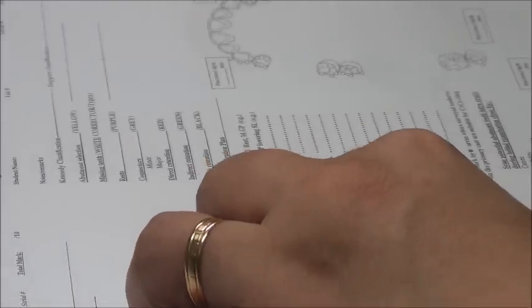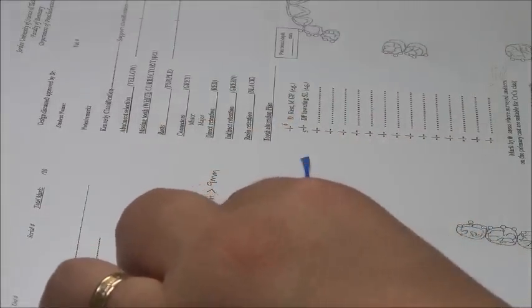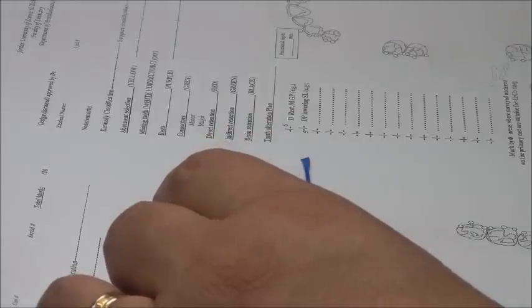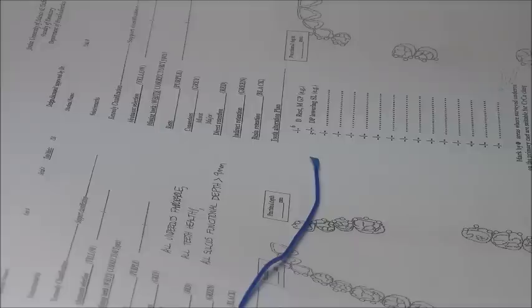The case after it, 2 pages after, here I need to add for indirect retention. Although my components are all complete in this case, this is the fulcrum line. If this is my fulcrum line, I have all components here and I can't place some of the components. I'm going to eliminate some of them. But the idea is, I can't place my components, but here I'm adding for indirect retention and for cross-arch stabilization together. I need to extend my design posteriorly. Okay?